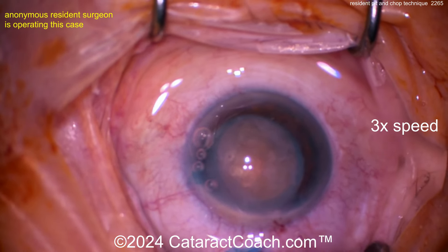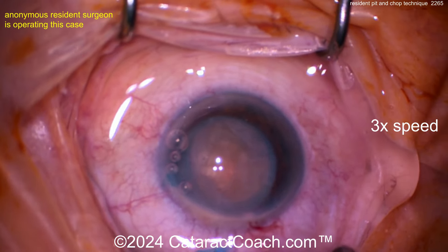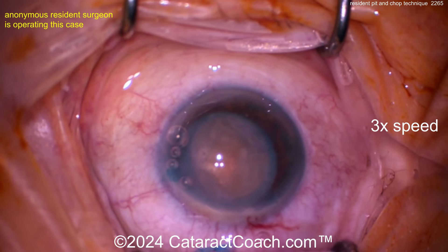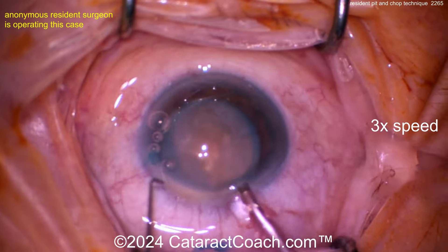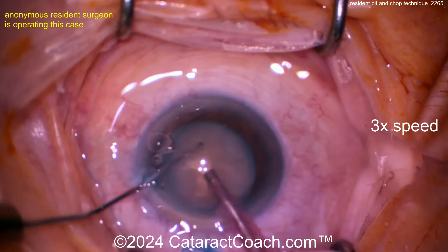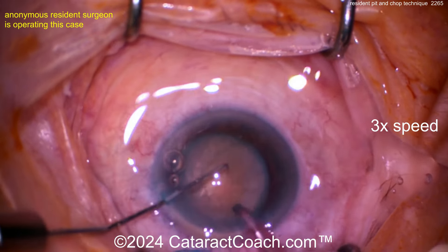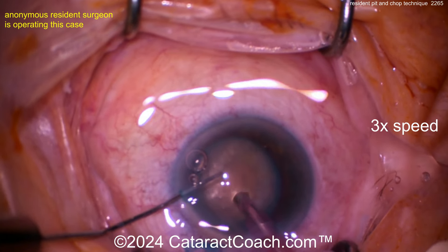A little more viscoelastic to protect the corneal endothelium. The pit and chop technique is to create a little bit of a pit — kind of like we learned from Mohanta's submarine chop — making a little pit in order to really get the phaco tip buried within the dense central part of the nucleus. So again making a little pit there, just a little bit of energy.